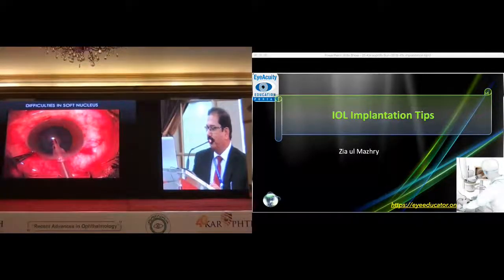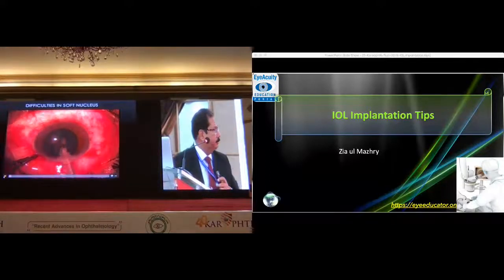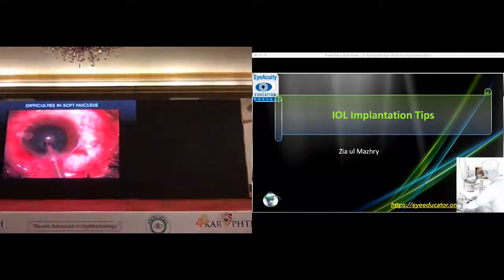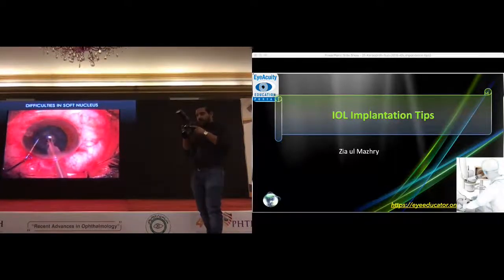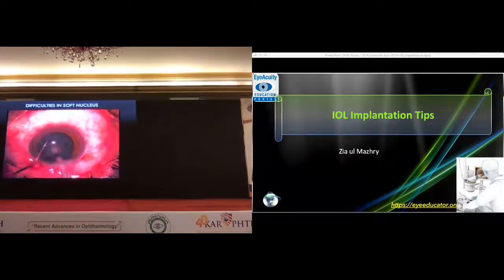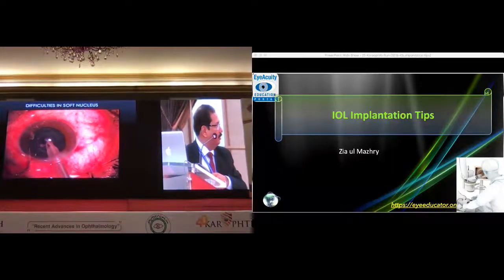Let's see what are the pure difficulties we come across when doing a soft nucleus. We are afraid of not going down — we don't want to go deep into the nucleus because it suddenly tries to jump. So we are afraid to go deep, but it's so tenacious. Usually the soft nucleus is very tenacious and doesn't separate; it behaves like a thick gel. And we don't know how to go deeper to avoid PCR. You can see that it divides mysteriously but then just refuses to divide.